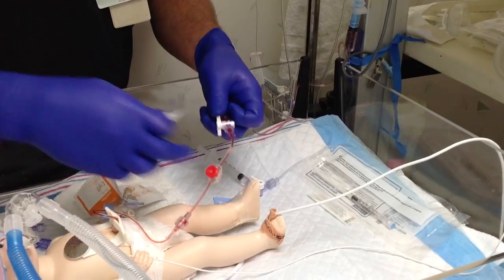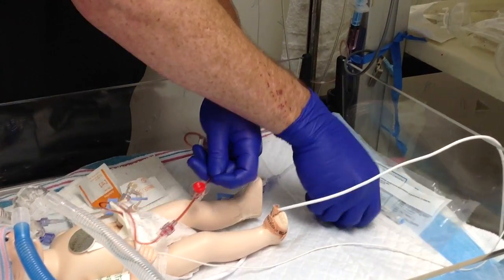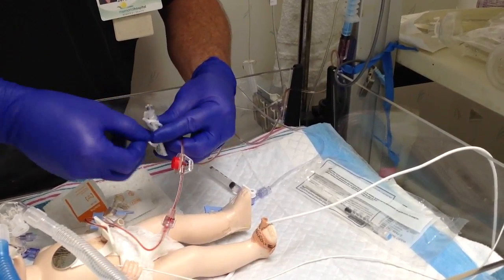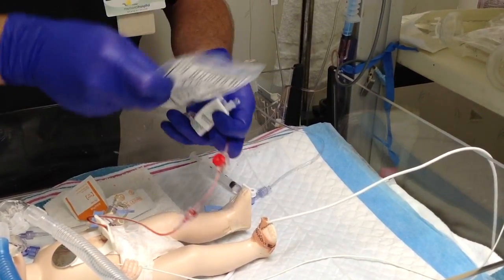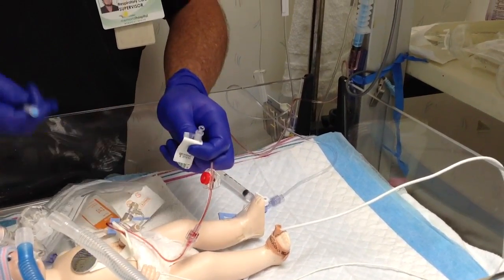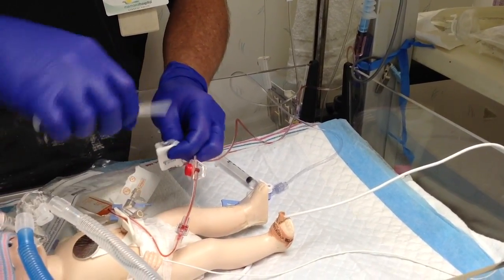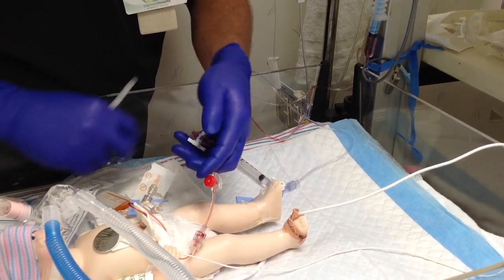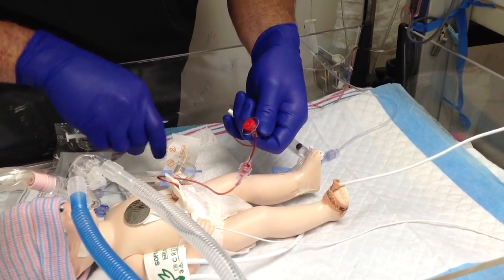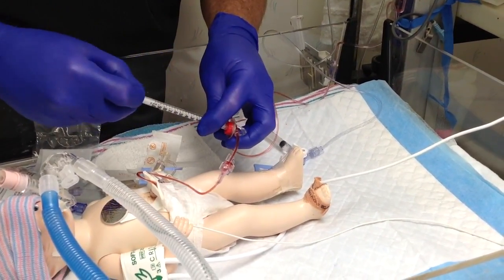You then want to grab your alcohol swab and wipe your draw site clean. For this type of UAC system, we use blunt tip needles — they're a lot safer for everybody. Place your blunt tip on, insert it into the red draw site, and pull back slowly. For our blood gases, we pull about 0.3.